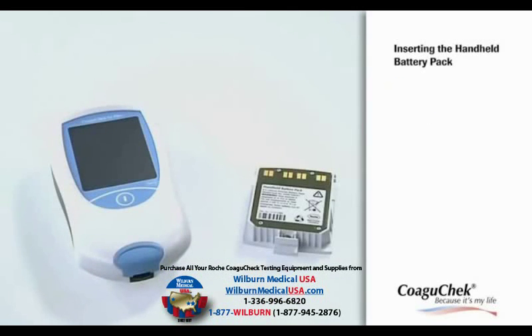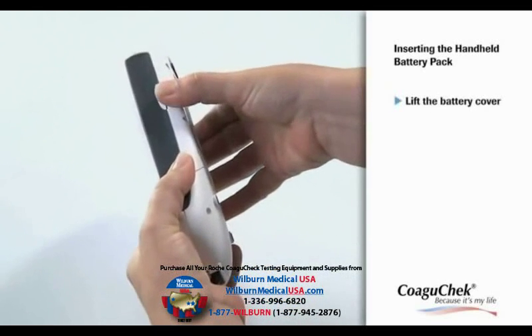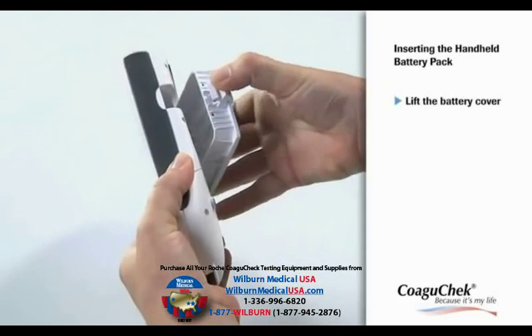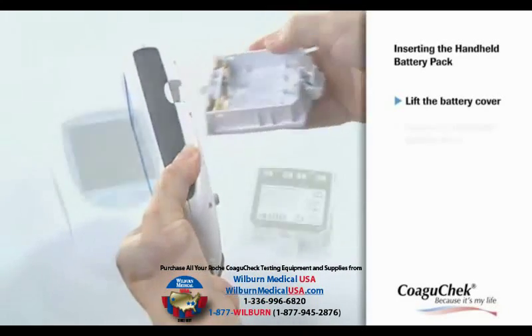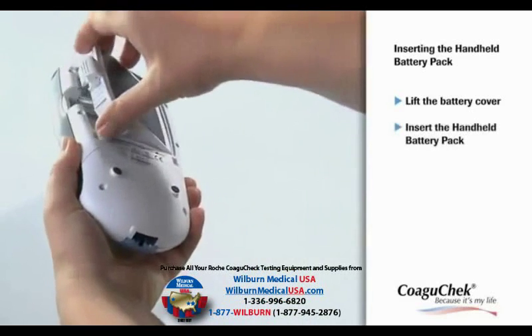Additionally, the optional Handheld Battery Pack is available. To insert the Handheld Battery Pack, please gently press the tab of the battery compartment cover and lift the cover to the side. Substitute the battery compartment and slide in the Handheld Battery Pack.